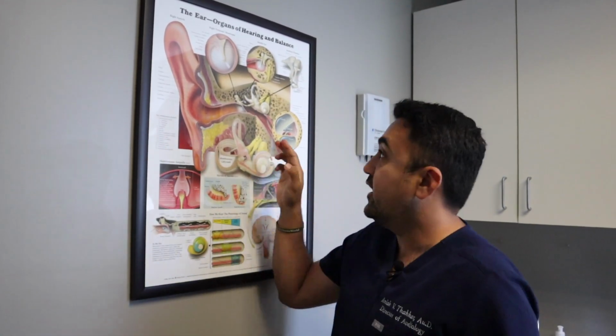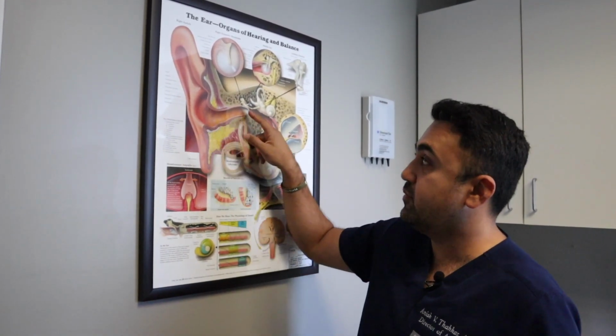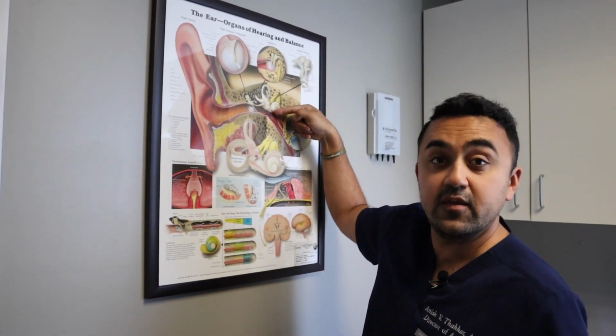Bone conduction hearing, as opposed to air conduction hearing, is when we put a stimulator, it's called a bone oscillator, right on the mastoid process of the temporal bone, and we are able to stimulate the bone directly. What that does is we skip the ear canal, we skip past the eardrum, the malleus, incus, stapes, and through bone, we're able to stimulate the cochlea, our hearing organ, directly.